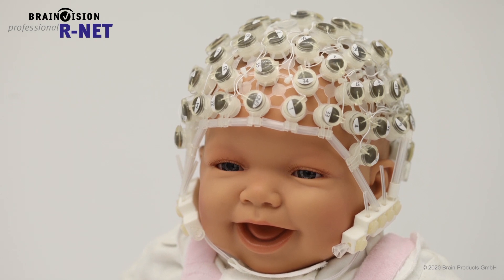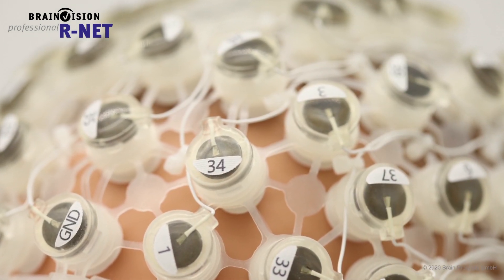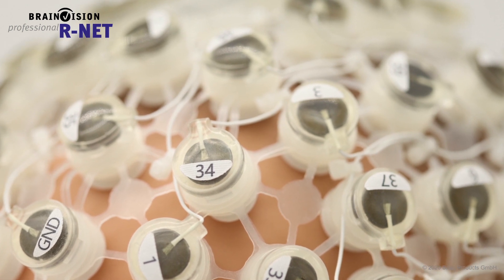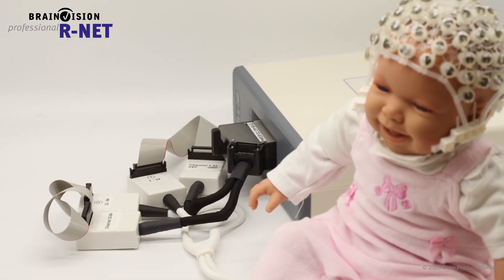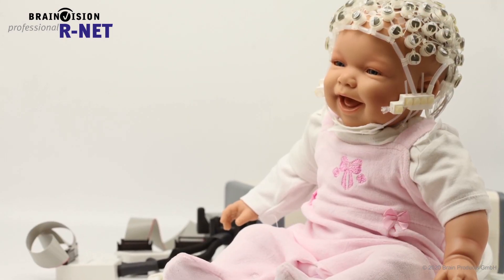Perhaps you are working with sensitive populations and are looking for fast preparation times and a high level of comfort for your participants. Then the R-Net is the best electrode system for your needs, available from infant to adult sizes.